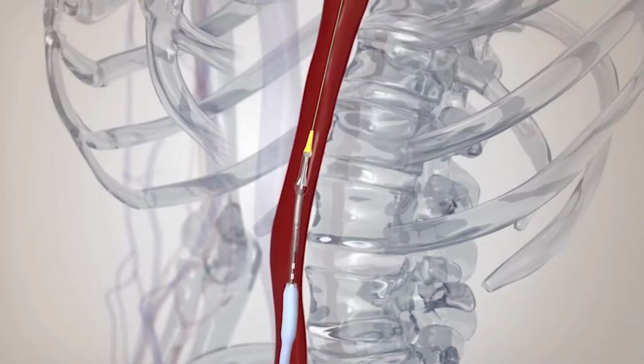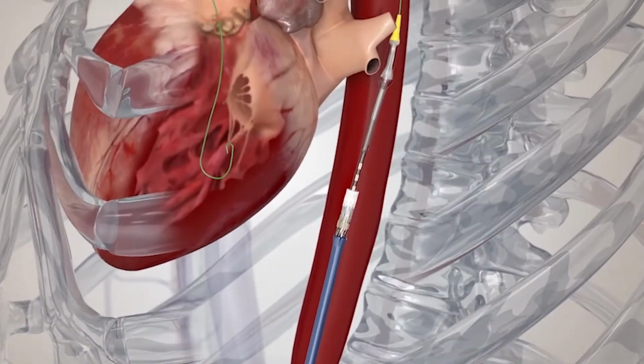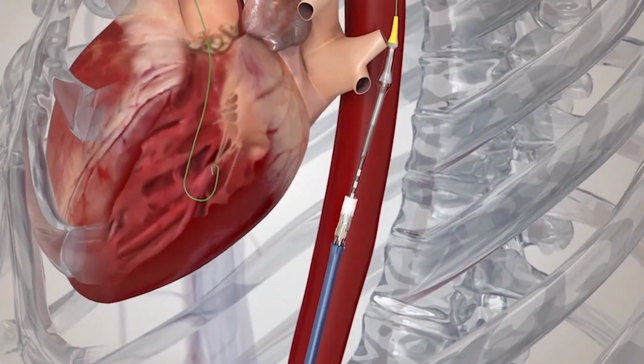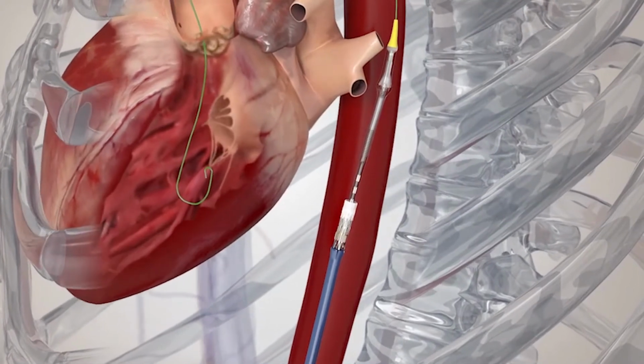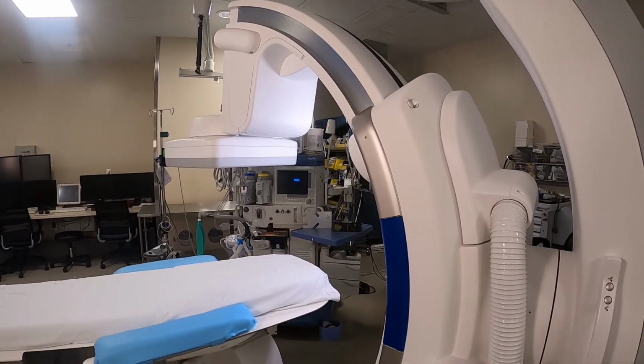With this procedure, which is minimally invasive, with the help of our cardiothoracic surgeons, we use an alternative approach where we usually use a big artery in the leg to get up to the heart and minimally invasively replace the aortic valve. The procedure itself takes about 2 hours, so the overall length of stay is about 2 days in more than 90% of the patients, compared to previously when we did open heart surgery for about 4 to 7 days, depending on how the patient recovered.